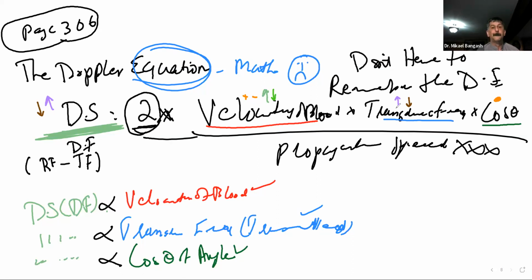Good is good, but then too much good may become bad. So that's why we say we can reduce the transducer's frequency, meaning it's okay to reduce the Doppler shift to make it come back from bad back to normal good.